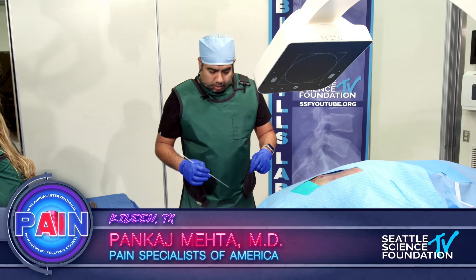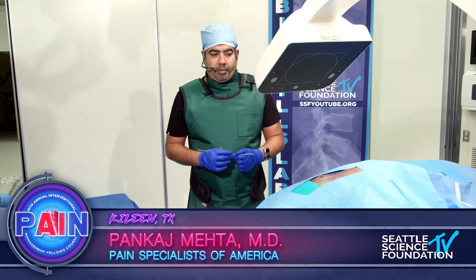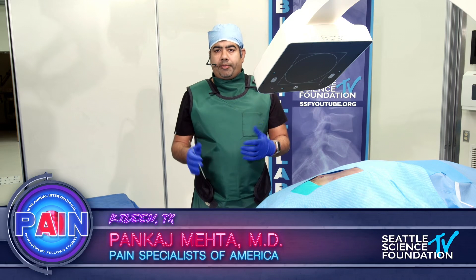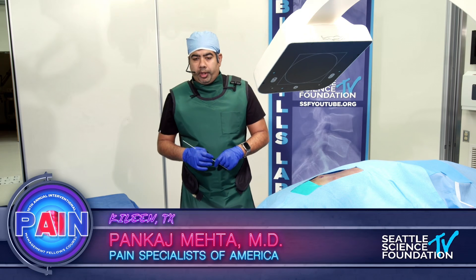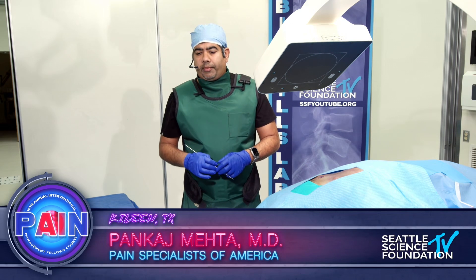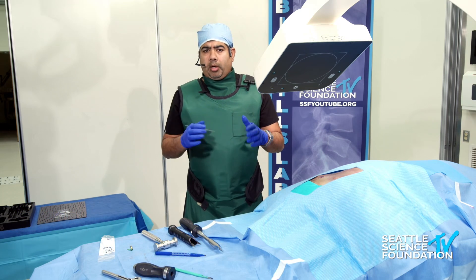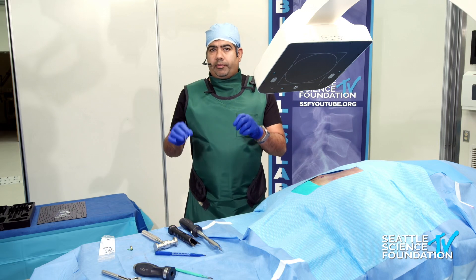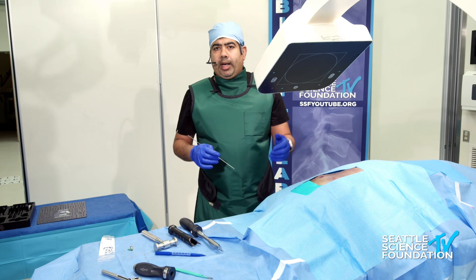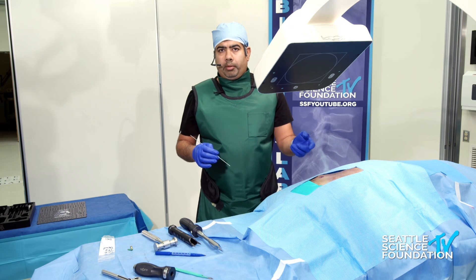That was an excellent demonstration by Ramo on the posterior approach. What I'm going to do is demonstrate the posterolateral approach with hardware placement and transfixation technique, which Doug just mentioned. Transfixation satisfies code 27279. The approach is pretty much the same as what Ramo showed, and there are a couple of things we need to make sure of when putting in the transfixation screws. The SI joint line or the river line with the PSIS is pretty much what Ramo just showed you.